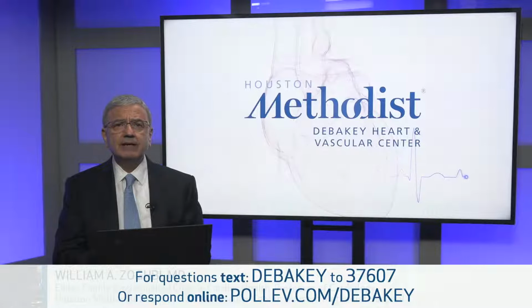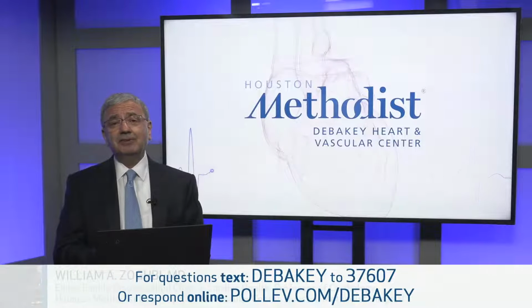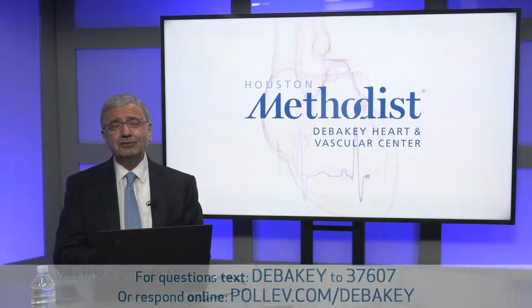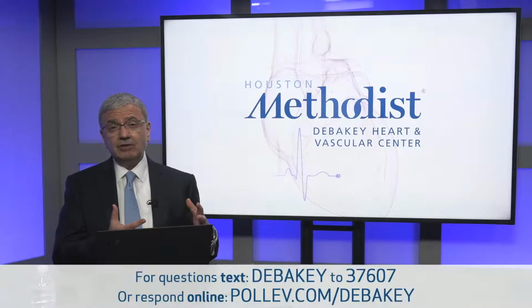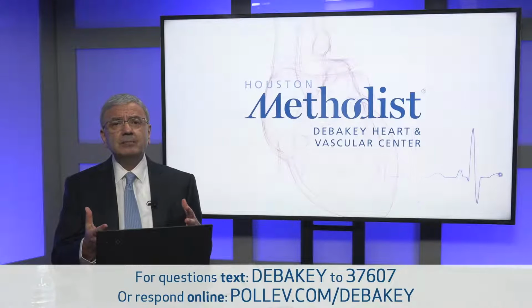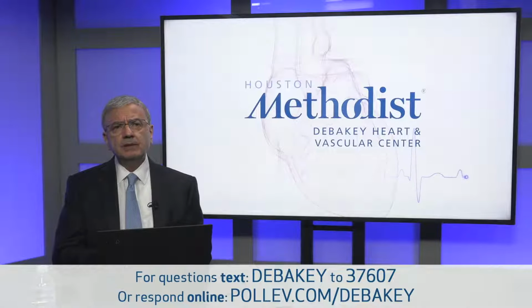Is MCE as accurate in atrial fibrillation as in sinus rhythm? If it is for ventricular function, yes, it is as accurate and as variable as you see with any function. Remember, it's going to depend on the RR interval, what your end diastolic and end systolic volume is going to be, what the ejection fraction is going to be, what your strain is going to be, if you have variability in the rhythm. And if you're talking about perfusion, I'm really not sure. I think probably not as much.